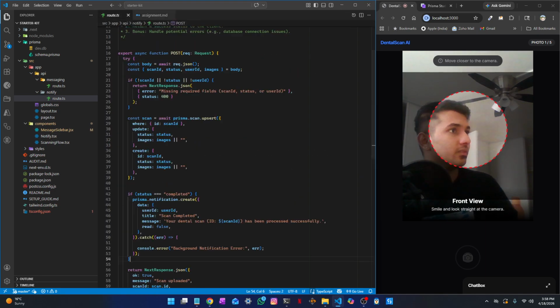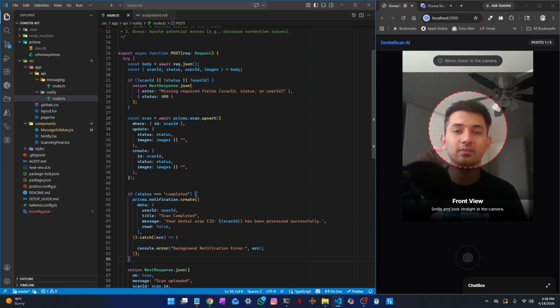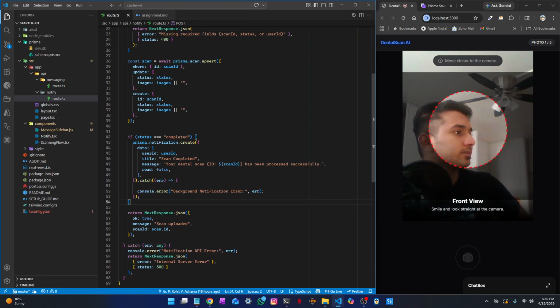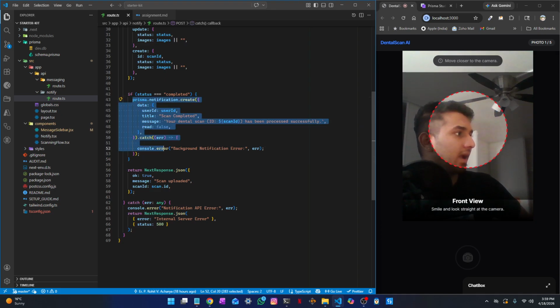So basically whenever the user uploads, there's a boolean that's by default false, and at the clinic's end, they can mark the notification as read. That makes the UX for the clinic very convenient, because they can go through all the images which are read, and they can also know which pictures haven't been read. So this is what I'm doing at the back end.